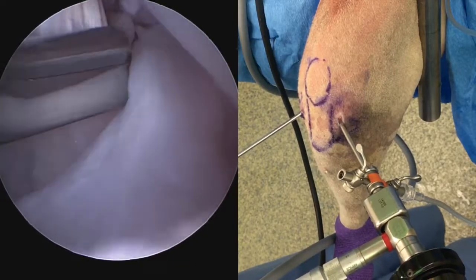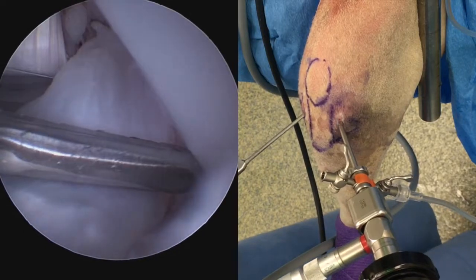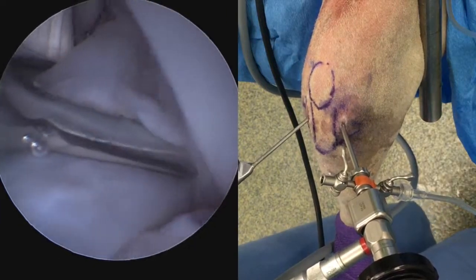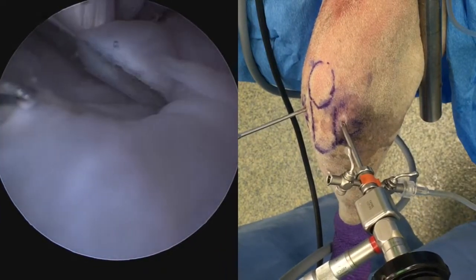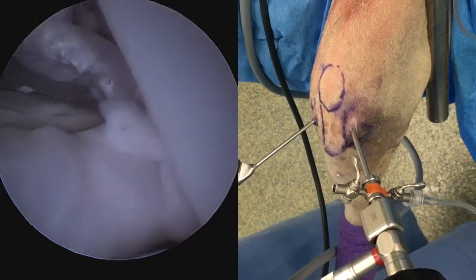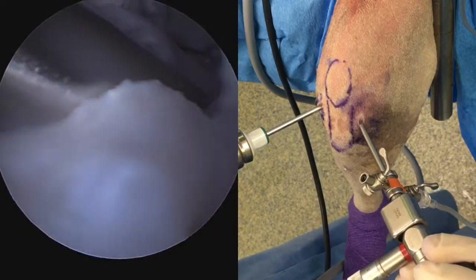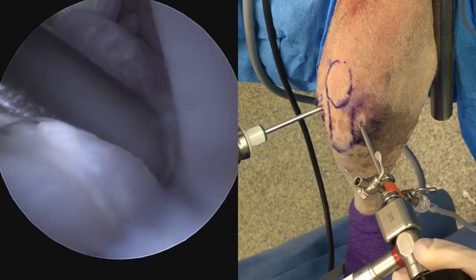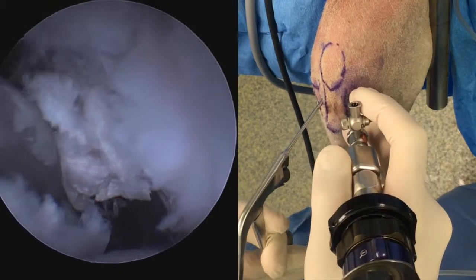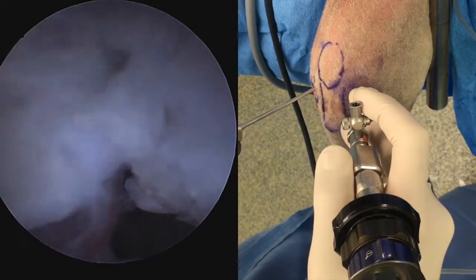To simulate a cranial cruciate ligament tear, we're going to transect and actually remove most of the cranial cruciate ligament. This is done in a number of ways. Here we're doing it with an arthroscopic punch device, coming mid-body, and it will take several bites as well as possible shaving in order to work our way through this fairly large structure. A final punch is being shown here, and complete transection is observed.